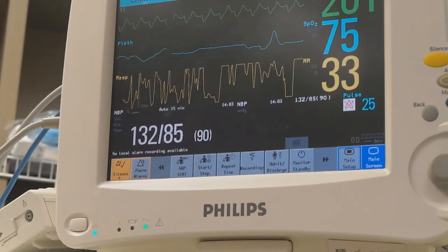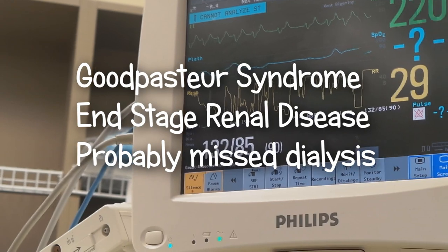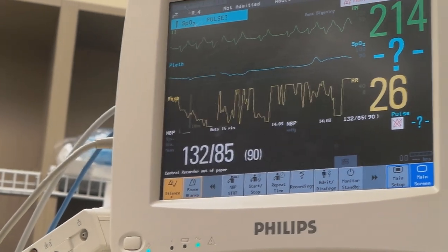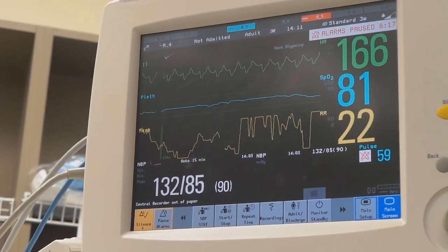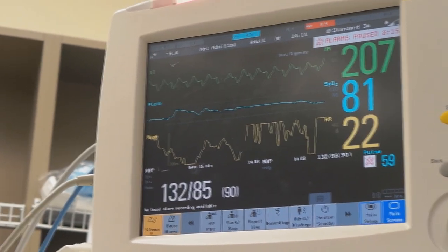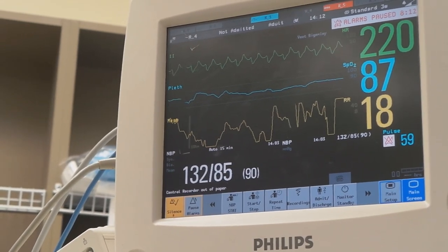So why is it reading a heart rate of 215? I think it's picking up the T waves as well as the QRS complex, so I'm thinking it's double counting. The potassium — her potassium is greater than 8.5.